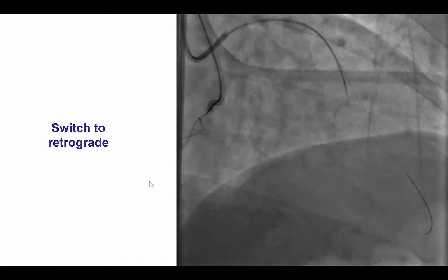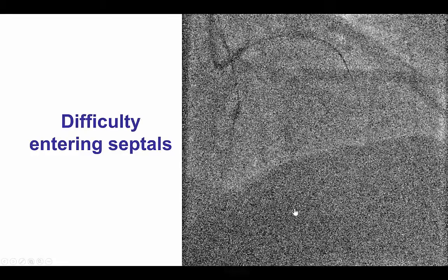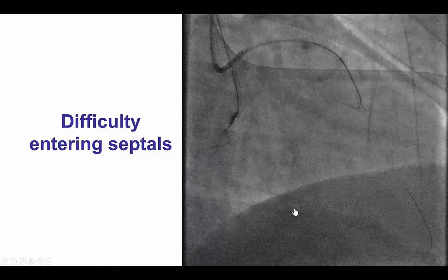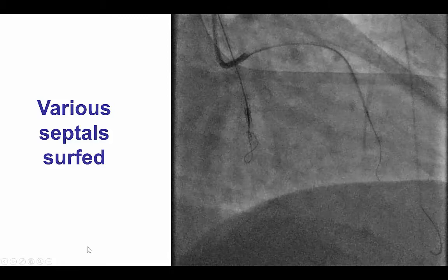As a result, we decided to give a try to retrograde crossing as the collaterals appeared to be favorable. We had some injection of the collaterals showing some connection to the PDA. However, this was not connecting, and then we had difficulty entering into more distal collaterals. Unfortunately, despite surfing, several of those collaterals were unable to go retrograde, which is something that happens in about one in five retrograde cases.